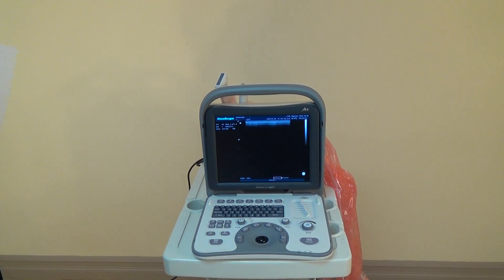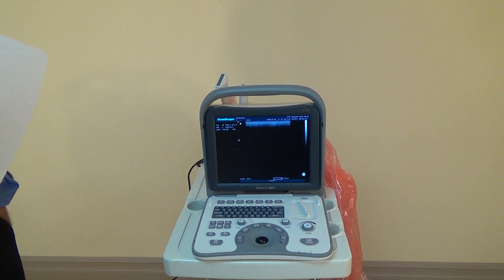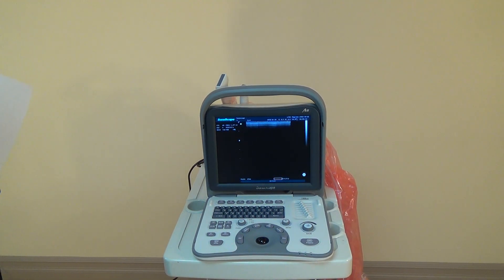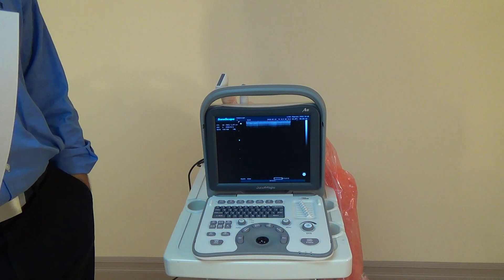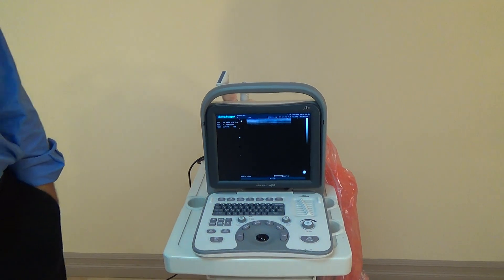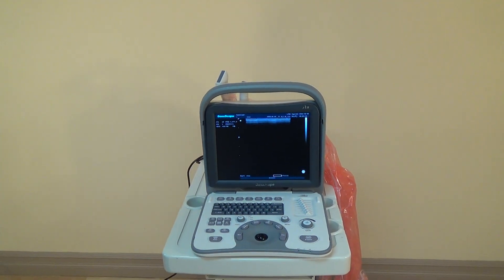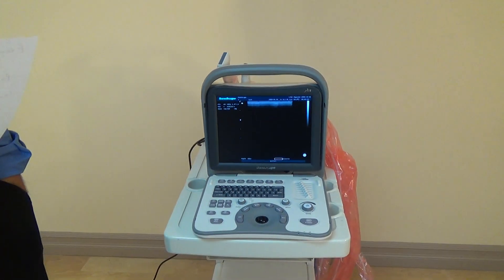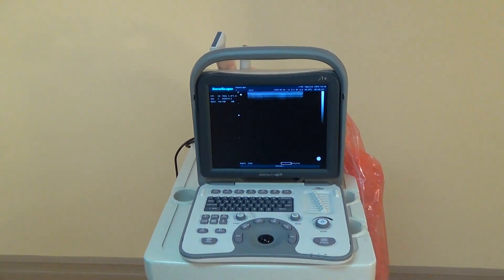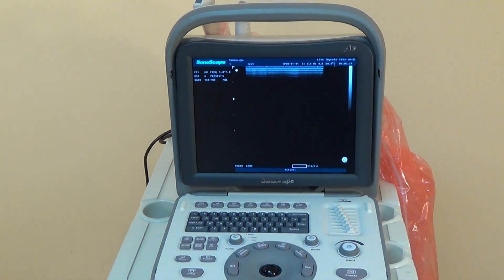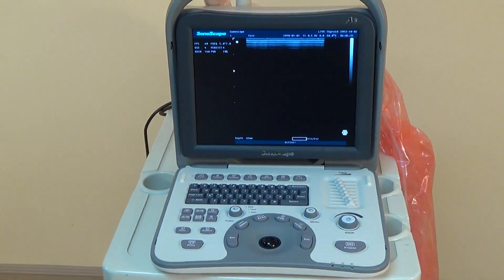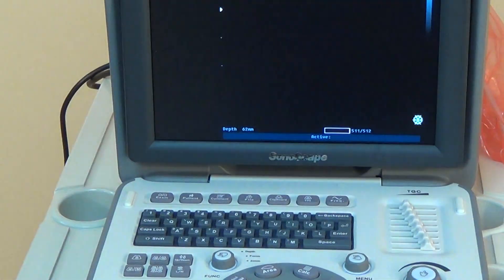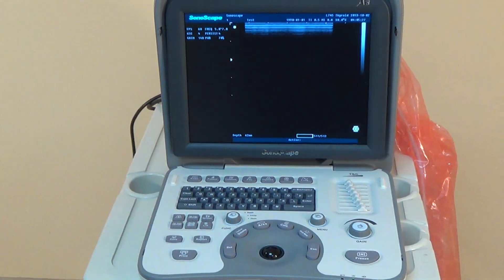Alright, this is Theo from KeevoMed again, going over some of the keyboard features of our A6 Sonoscape Ultrasound machine. We had some other videos on the machine covering some of the functions, capabilities, and benefits of this machine. We're just going to go over the keyboard here really quick.